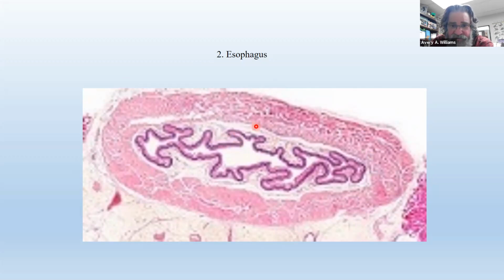And obviously you can see that there are different kinds of tissues here. Here's a tissue, there's a tissue, here's a tissue, and there's some tissue out here. What are they? Well, you're always going to have epithelial tissue, connective tissue, and muscle tissue most of the time. Epithelial tissue always lines the inside, so this inner lining is going to be an epithelial tissue. And it covers the surface of your skin, the epidermis, so epithelial tissue. Everything else sandwiched in between is going to be connective tissue.